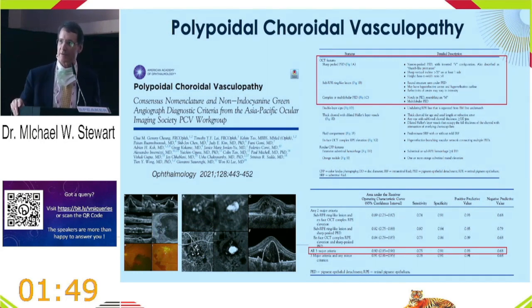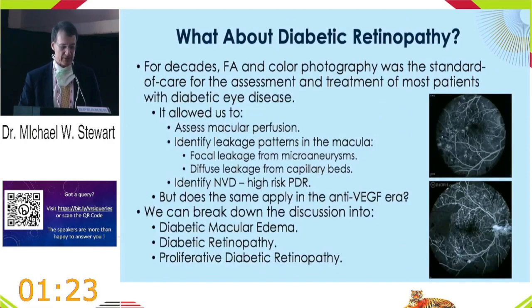Dr. Sada was on this committee, Dr. Gupta. And the bottom line of this was it's about 90% effective when you look at the major three diagnostic criteria from OCT, and that is the sharp pigment epithelial detachments, the sub-RPE ring, and the multi-lobar pigment epithelial detachments. So 90% is pretty good, but you will lose 10% of your lesions, not being able to diagnose them.